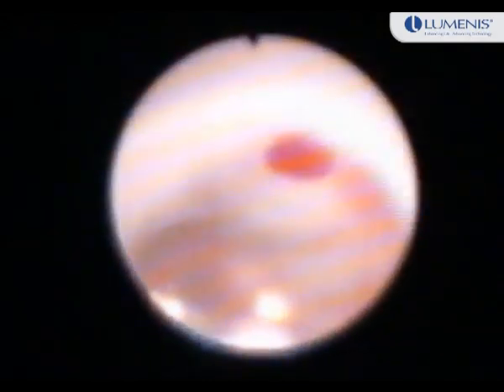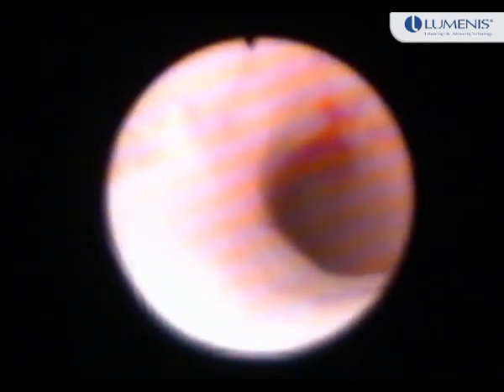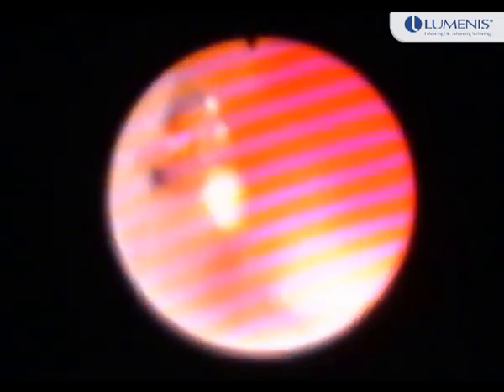We removed the ureteral stent and introduced a 9.5 French ureteral access sheath up into the pelvicalyceal system. The pre-placement of the stent helped considerably in inserting this sheath in a one-year-old child. After entering into the pelvis, we could see a 1.5 centimeter stone sitting in the upper calyx. We used a 365 micron fiber through a 7.5 French flexible ureteroscope and targeted the stone.